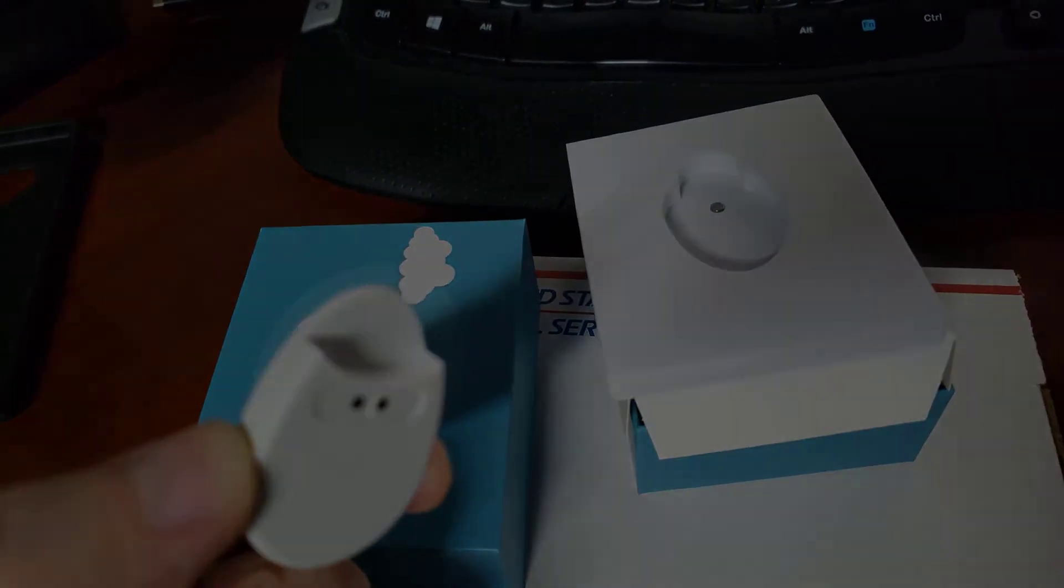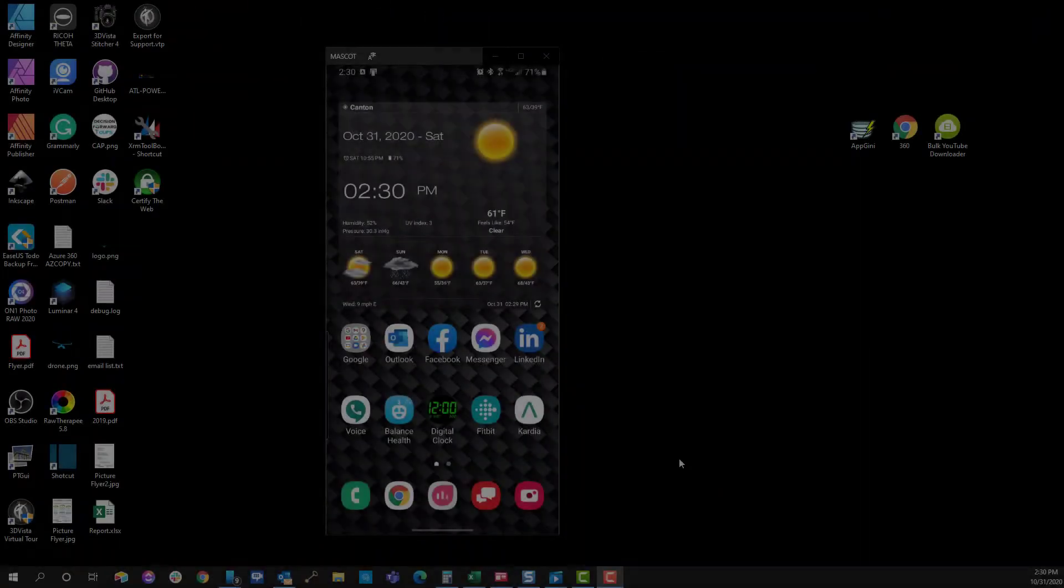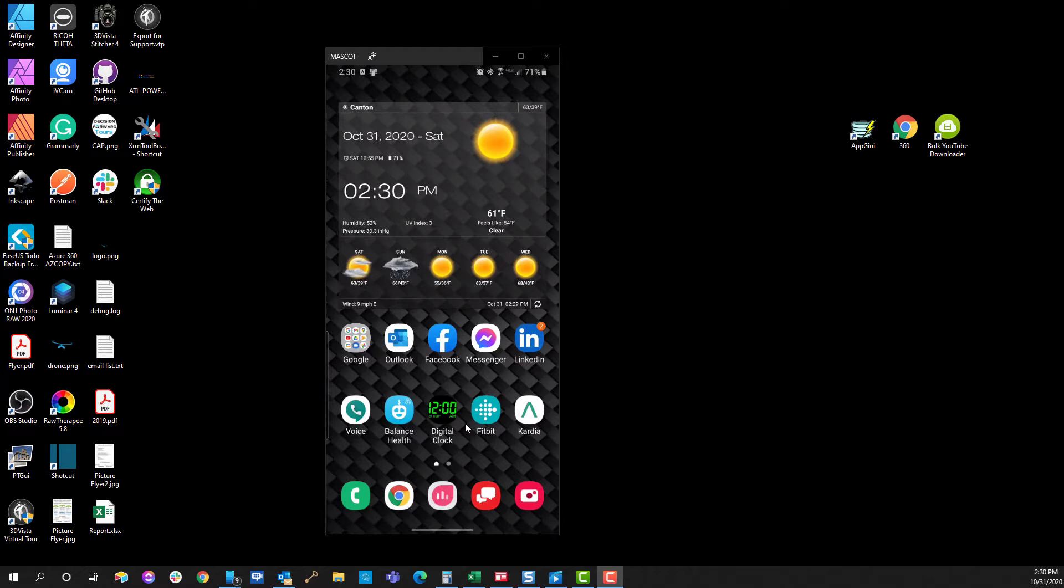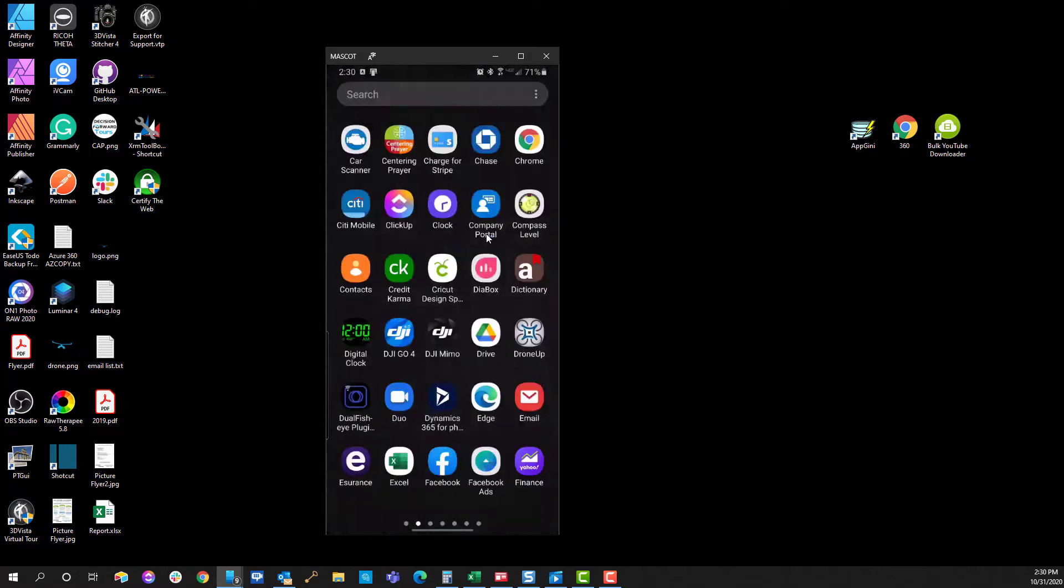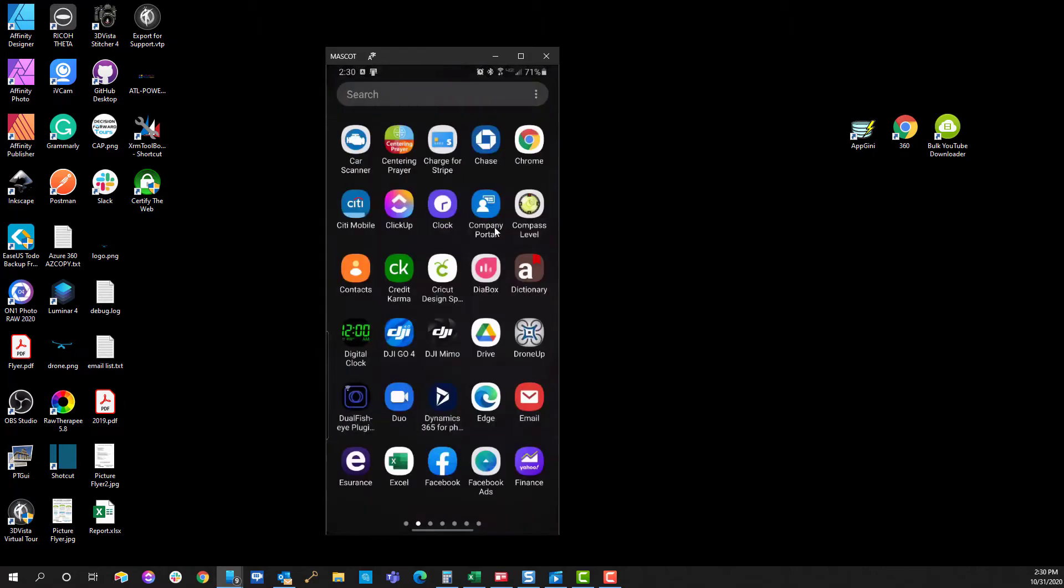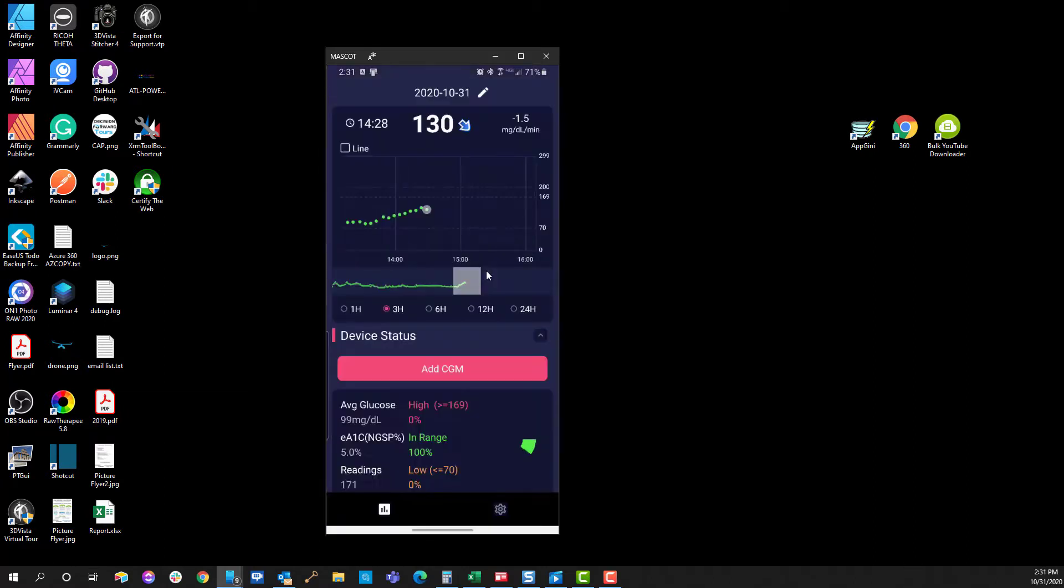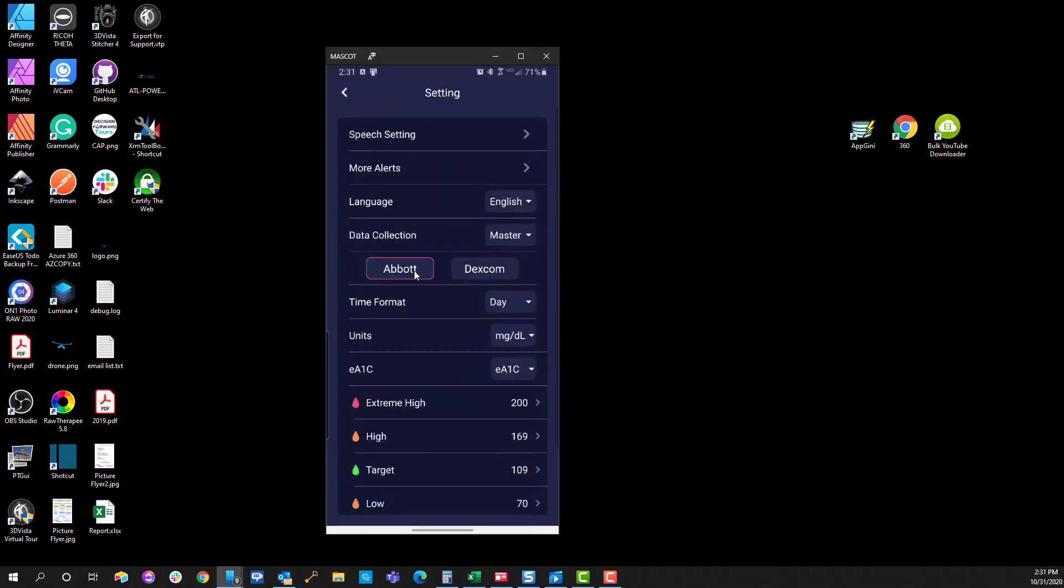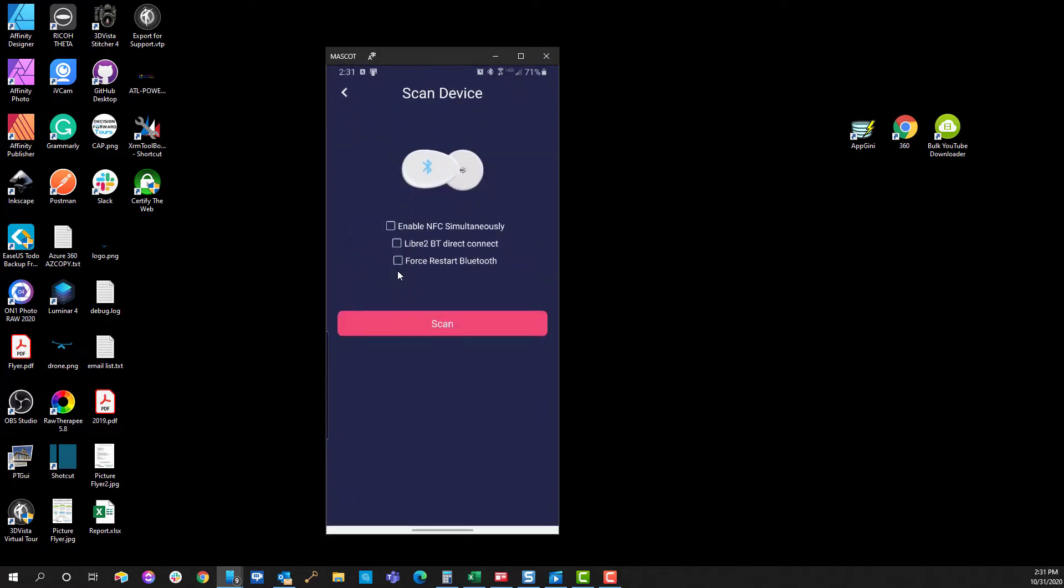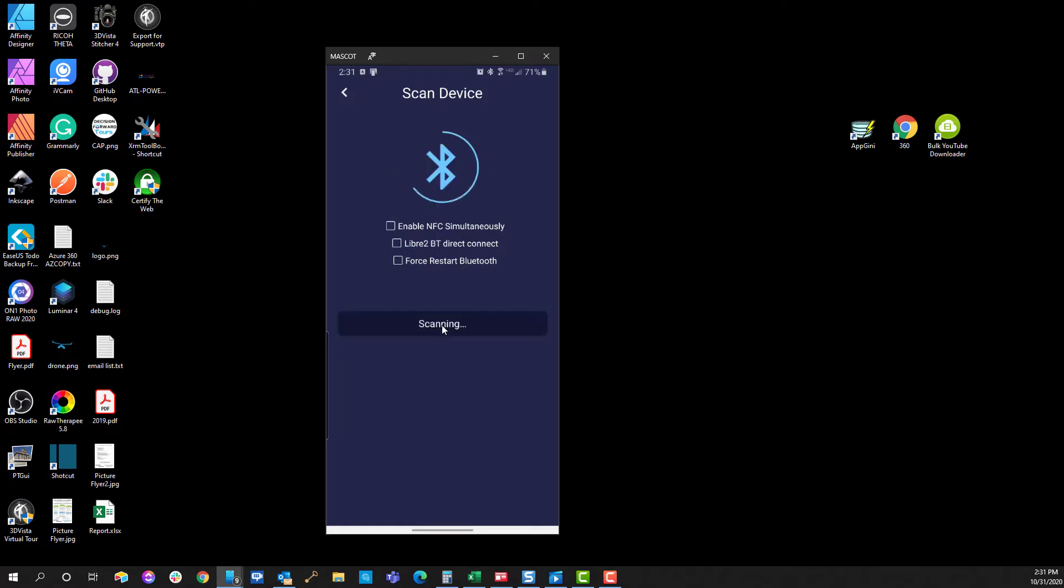Here we are inside of the Android application. The first thing you're going to want to do is launch the Diabox application. You can do that by going into all of your apps. I'm on an Android phone—it'll look a little bit different on iOS—but the application should look pretty much identical. The first thing you're going to need to do is add your CGM. I had mine connected, that's why you're seeing data up here. I'm going to choose Abbott because this is an Abbott sensor, the Freestyle Libre. The Diabox application actually works with the Dexcom device as well.